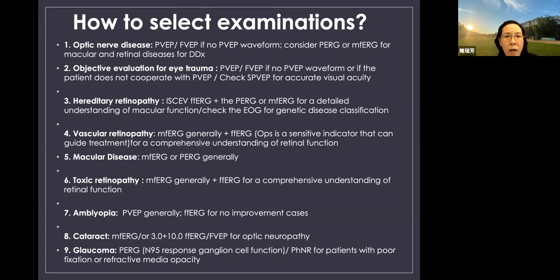Of course, visual electrophysiology is not the only examination we need to order. For the clinicians, we also need to order imaging. Hereditary retinopathy is a big group of retina and macular disease. In order to have a detailed conception of the disease, we always do standard FFERG.